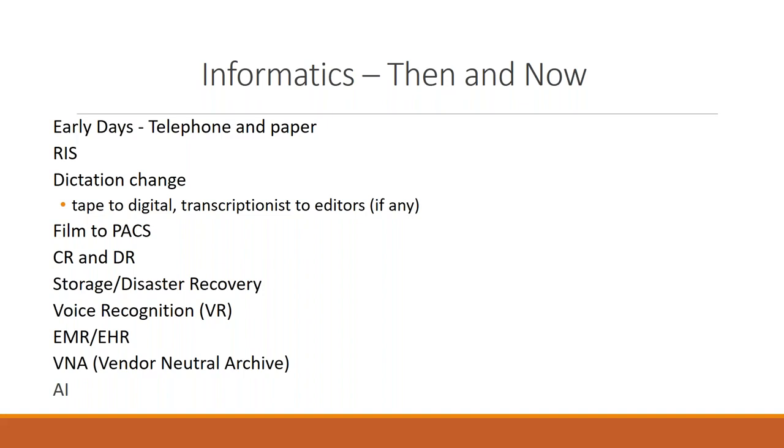There are so many challenges with other ologies now using the storage. We're going to show a slide in a moment that talks about how we used to be the sole provider of images to that storage cache. Now it's coming from all around, and we are no longer just the largest images or the largest files, but there are some that are even bigger than us. And now they're all going to the same place. In disaster recovery, no longer is downtime acceptable. If you're looking for a vendor, you should be looking for 99.99% uptime, which is very solid.